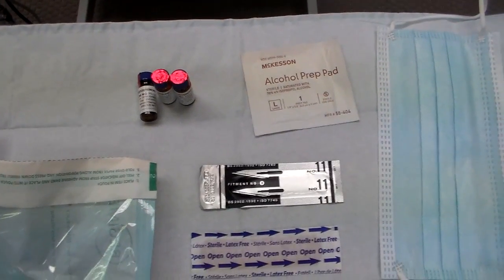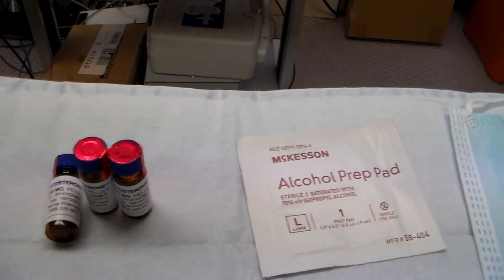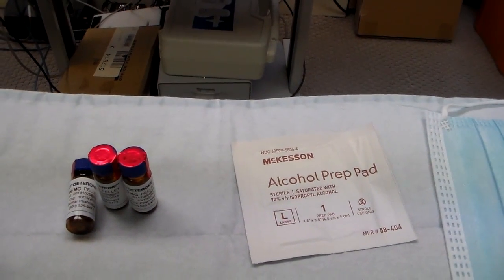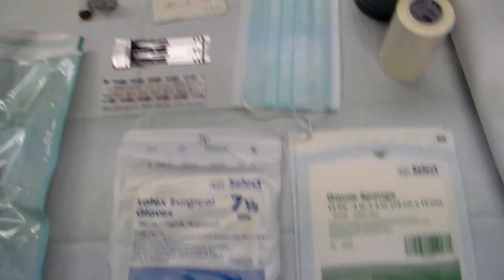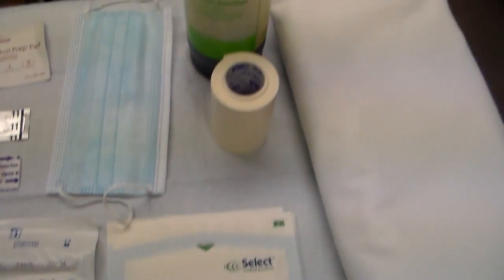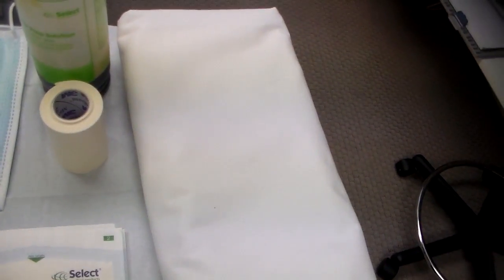Having the 11 blade available, as well as the testosterone pellets on the table, has to be determined by the amount the physician wants to implant. Sterile gloves and a mask are mandatory, along with gauze, tape, betadine, and a towel.